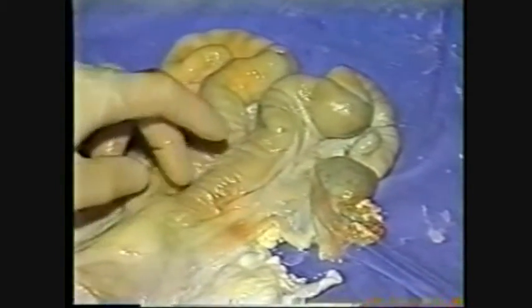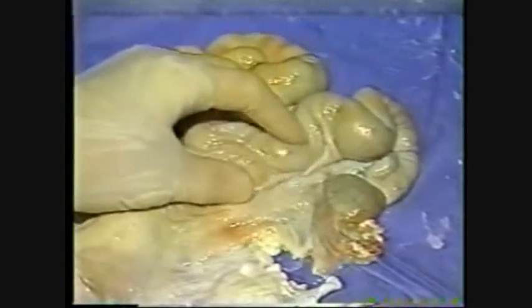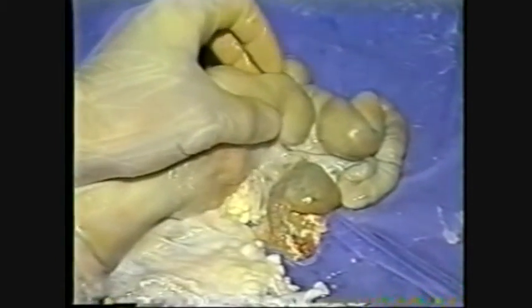Once again on this track, the internal septum, which we are not viewing, of course, has started way back here. So we have a division. We are down the right horn. Seems like a pretty good position. We'll stop at this point. You can palpate down, of course, and feel where the tip of the catheter is.